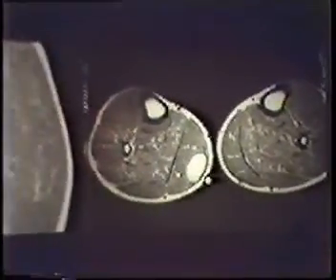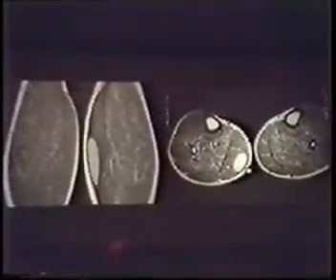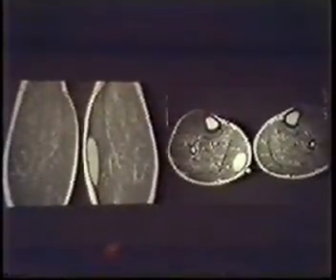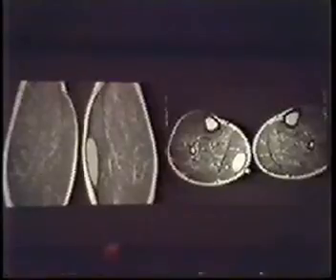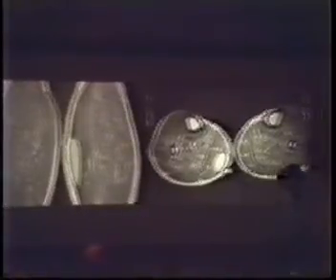And we've seen a number of these, and we've actually kept the surgeon out on a couple of occasions where he was going to go in to operate, and we could tell him that the actual muscle is intact, that in 2 weeks she'll feel much better. Very typical appearance. On a T2-weighted image you could see the actual fluid level there.